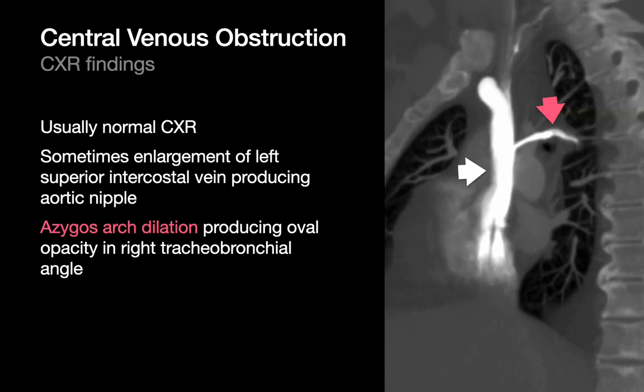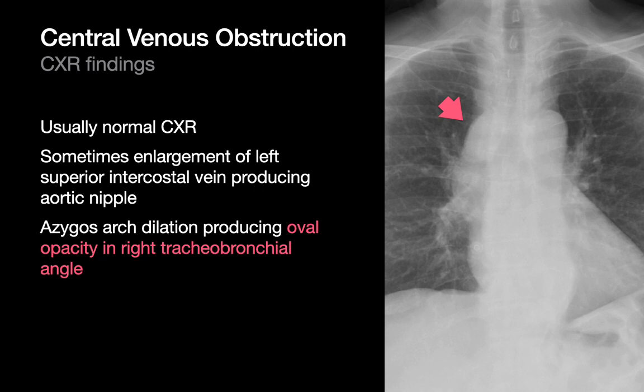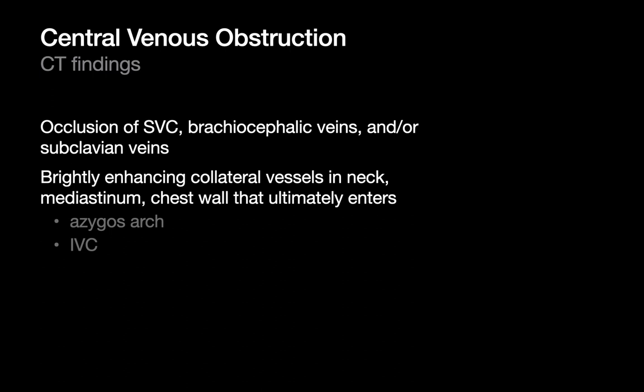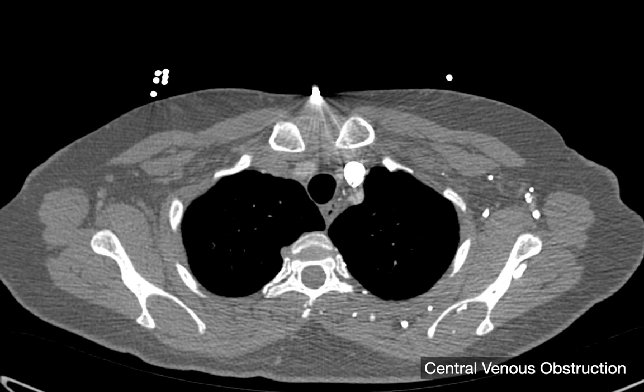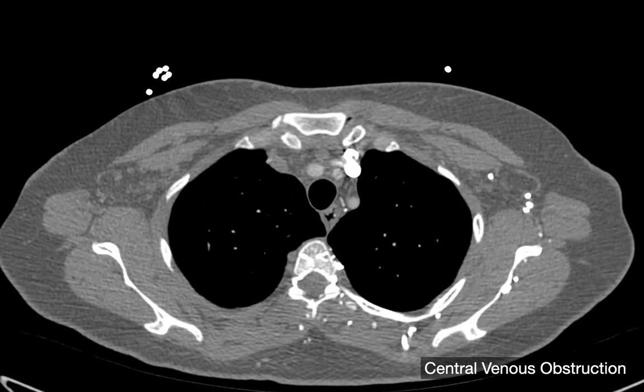With central venous obstruction, sometimes the azygos vein can be dilated too. I have a white arrow pointing at the SVC and a pink arrow pointing at the azygos. When it becomes dilated, you can see a large oval opacity in the right tracheobronchial angle, immediately above where the right main stem bronchus takes off from the trachea. On CT imaging, not only are occluded central veins often directly observable, but enlarged venous collaterals may be too. If you've injected intravenous contrast, these collaterals will be filled with brightly enhancing contrast, as on this example showing brightly enhancing contrast in many collateral veins in the chest wall.